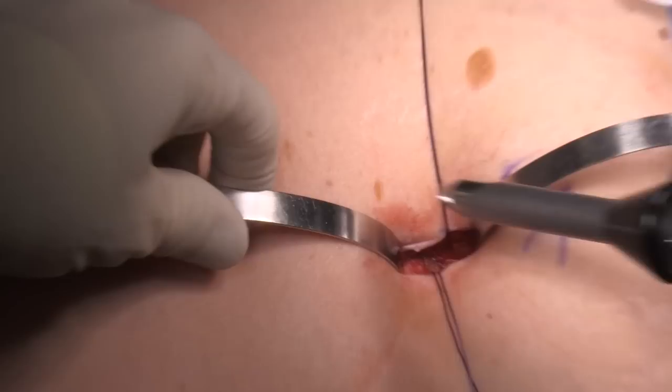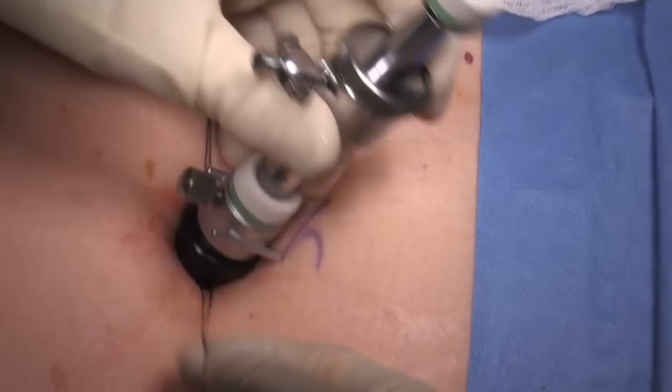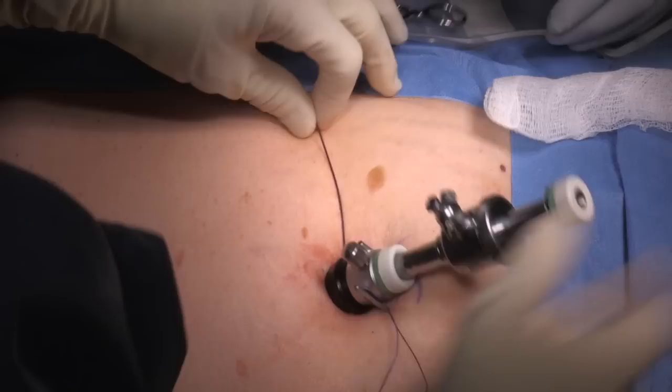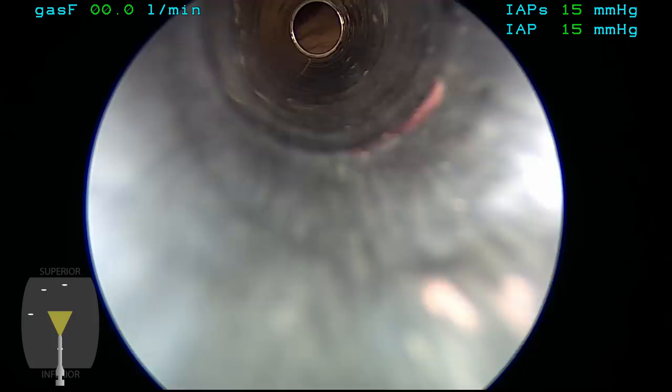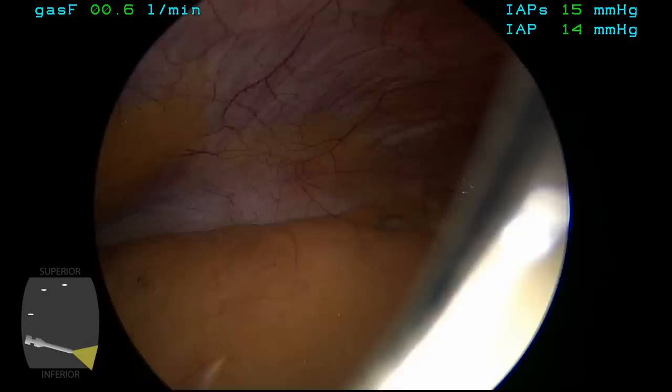One can see the opening in the fascia into the peritoneal cavity and then the Hassan cannula is then passed through this opening and it's secured in place by wrapping the Vicryl sutures around the suture rings on the cannula. The next step is to connect the CO2 tubing and inflate the abdomen to a pressure of 15 millimeters of mercury.